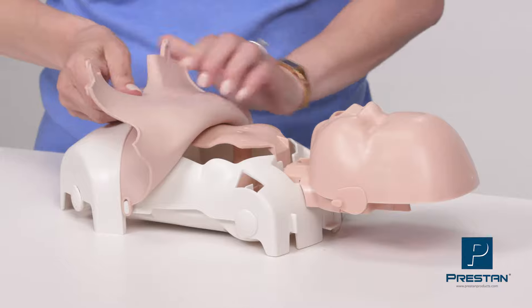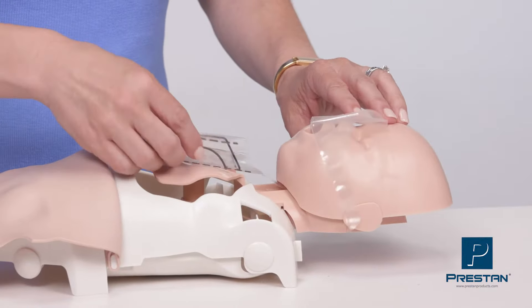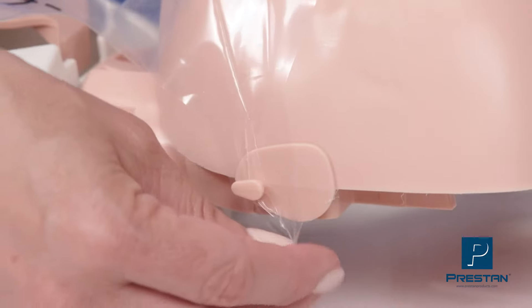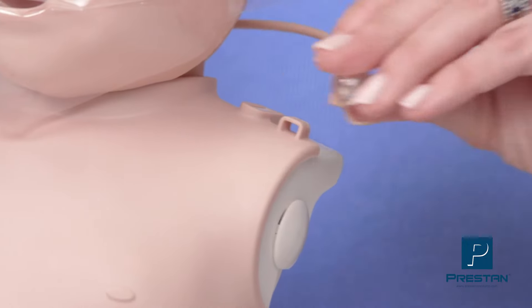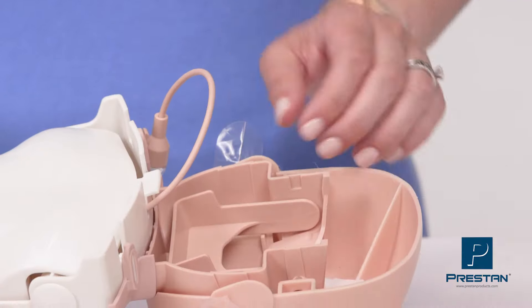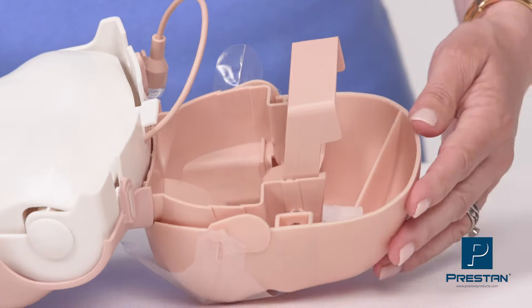Unlatch the skin tabs on each shoulder, peel back the skin, install the lung bag, and secure the face shield into place. Secure the LED sensor by attaching it to the loop on the left shoulder. Secure the head stabilizer and you're ready to train.